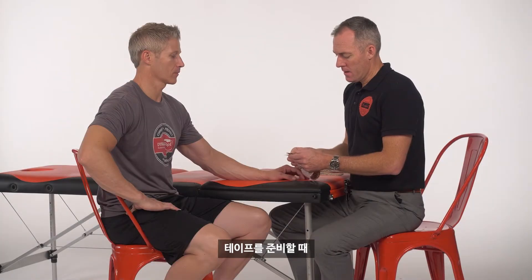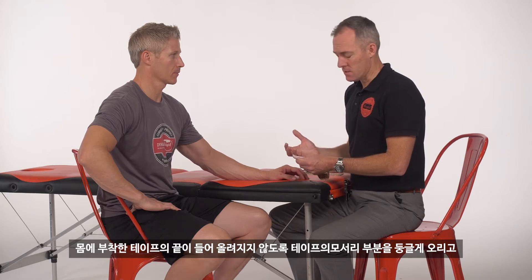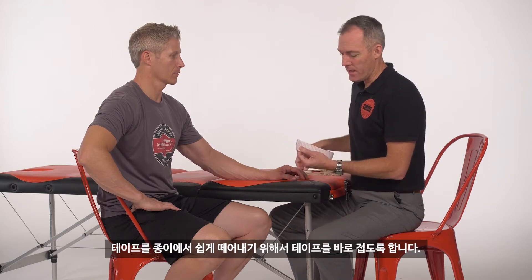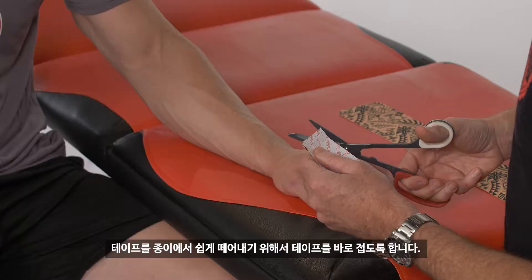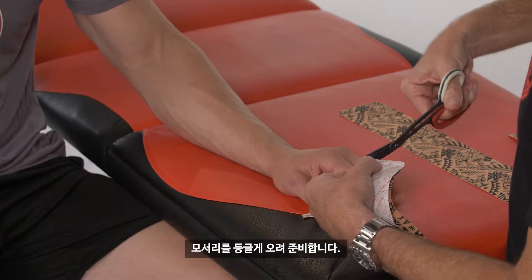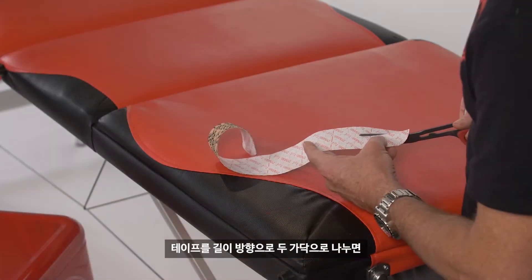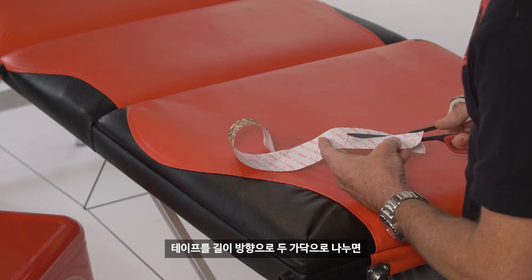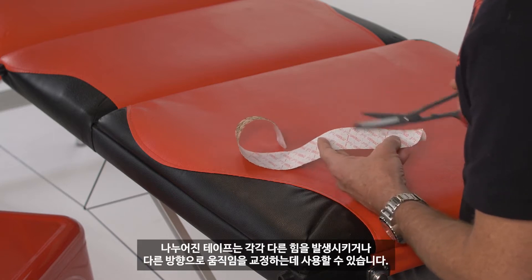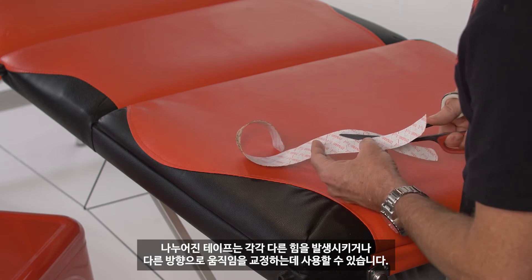When cutting the tape it's important to round the corners, as that reduces the chances of lifting and peeling. The simplest way is to just fold it back on itself so you only need to do it once and then simply trim off those corners. Splitting the tape down the middle gives us two separate tails that we can create different forces or different movement corrections from the same piece of tape.